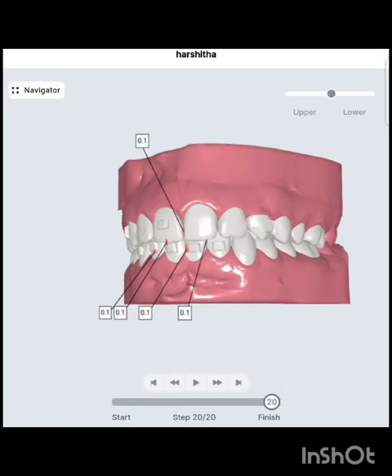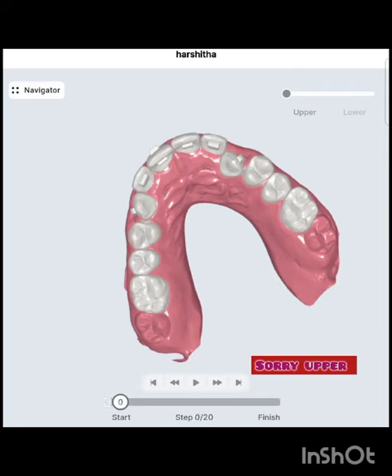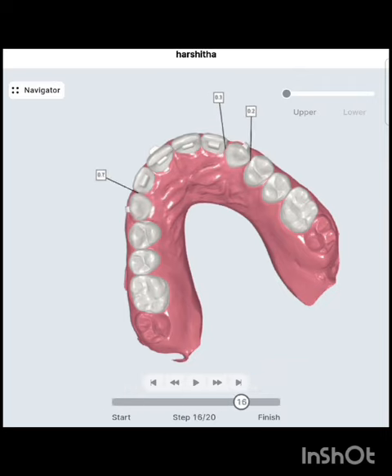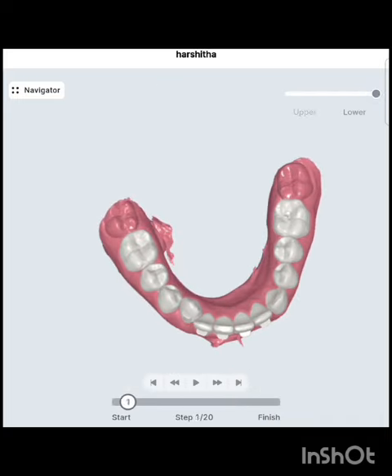This is the final projected result, and this is the lower arch. This was the initial condition. After all 20 trays, this is the result we are going to get — shown here for both the upper and lower arches.